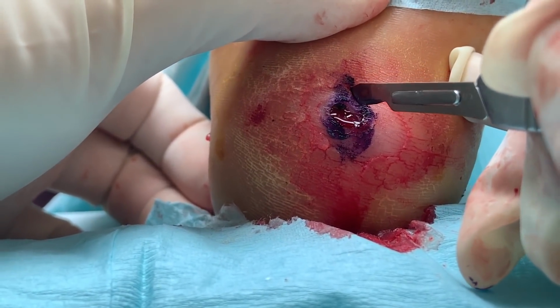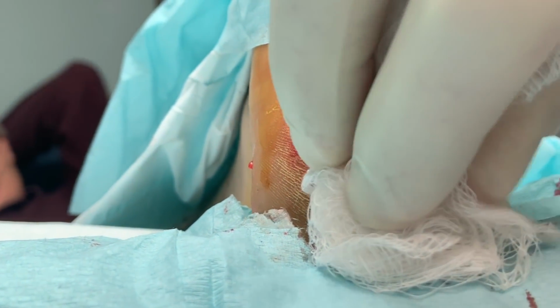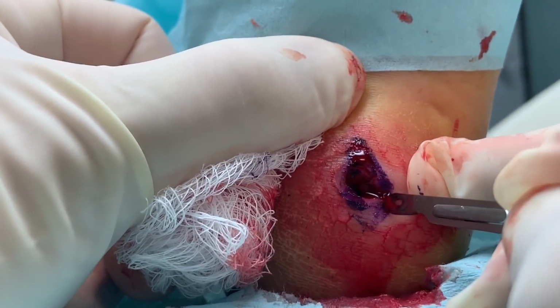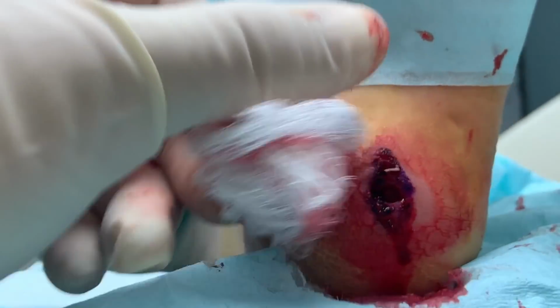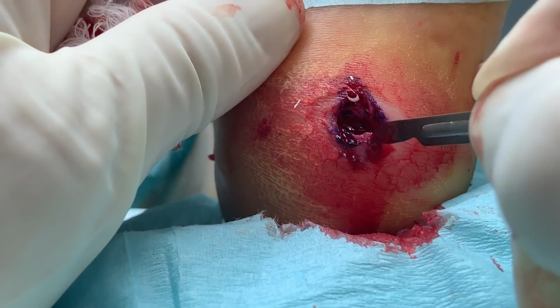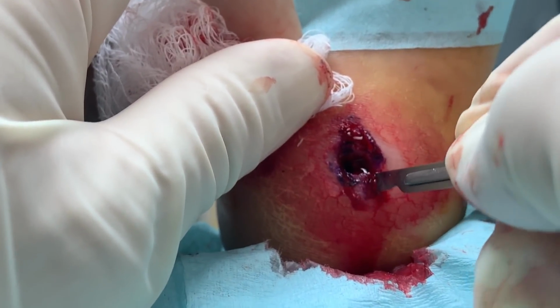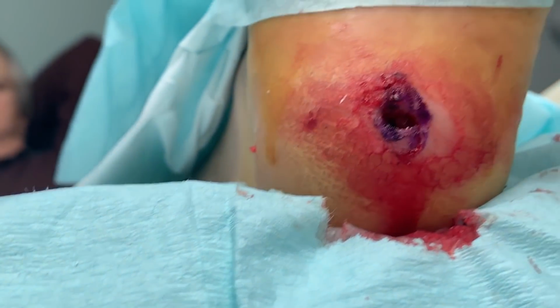Dab, yep, good job. Actually, I need some pickups. So in essence, we're gonna close this hole by creating a bigger one, if that makes sense at all. Okay, and once we get the pickups, we'll pull these out. Well, you have better tissue to work with, right? Yep, that's it. Exactly, more tissue.